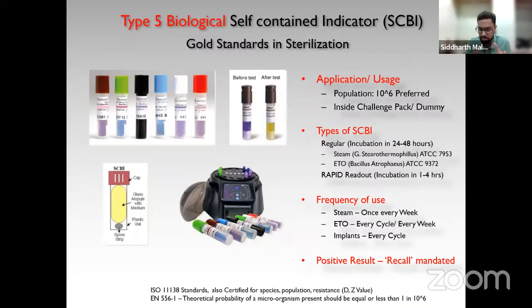However, because a lot of people are following it, others may also follow the same protocol. But this is very dependent upon how your hospital protocols are, how your sterile storage area is, how many times a person is actually going and touching that tray, whether you are storing it inside your OT or in a humid atmosphere, whether at 18 or 24 degrees Celsius. All these things will come into play. What we suggest is, it's a very difficult way to understand what is the total expiry time.